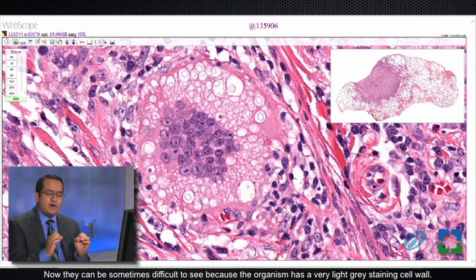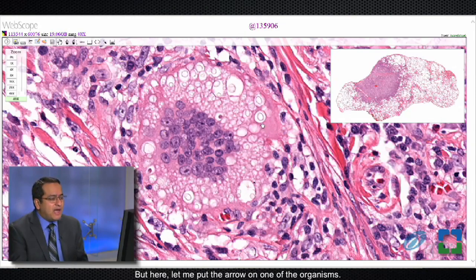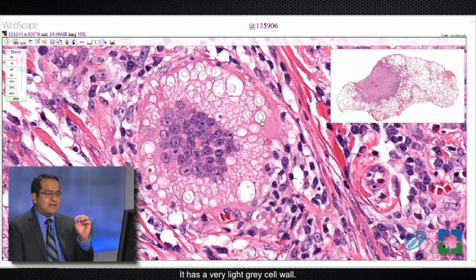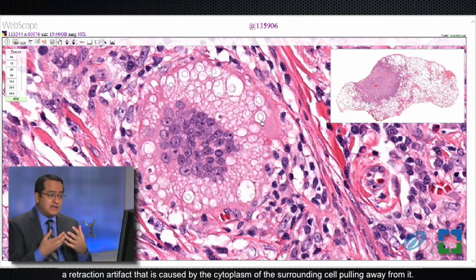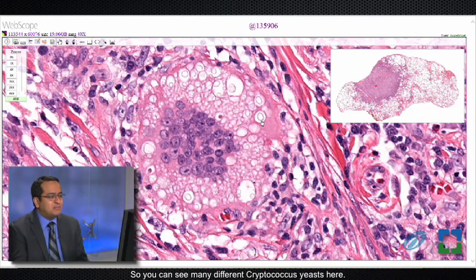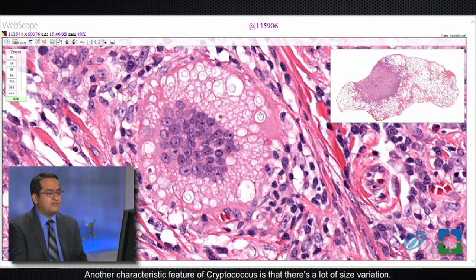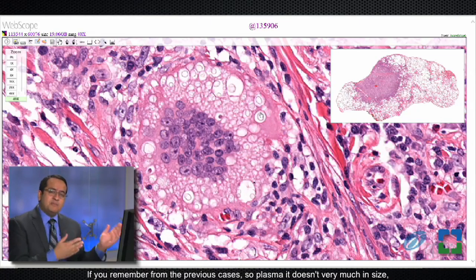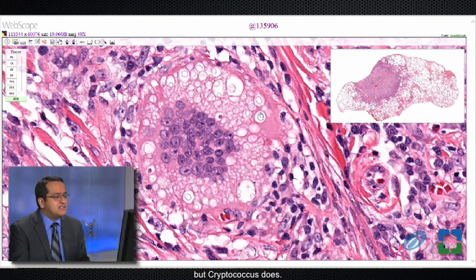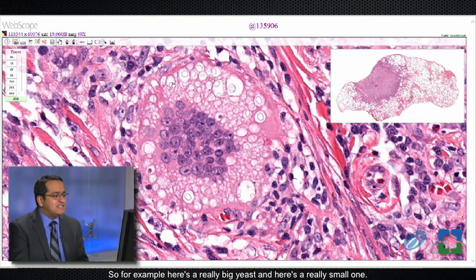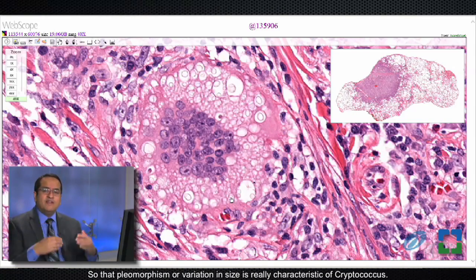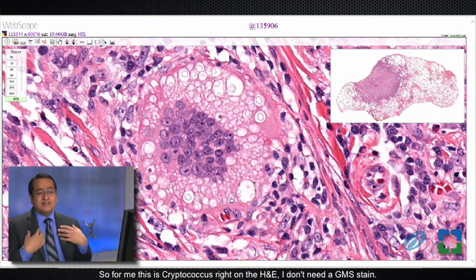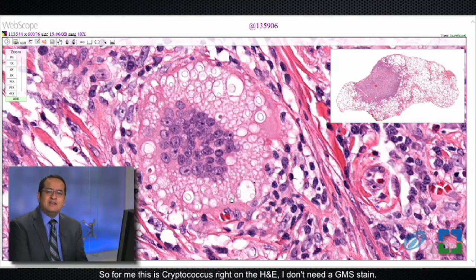This is in contrast to the previous case where you couldn't see organisms within the necrosis, and that's actually characteristic of histoplasmomas. In cryptococcus — which is what this is — you can actually see cryptococcal yeast right on the H&E. They can be sometimes difficult to see because the organism has a very light gray staining cell wall. It has a round or slightly oval shape and a space around it, which is a retraction artifact caused by the cytoplasm of the surrounding cell pulling away. Another characteristic feature is that there's a lot of size variation — unlike histoplasma, cryptococcus varies much in size — here's a really big yeast and here's a really small one. That pleomorphism or variation in size is really characteristic of cryptococcus.